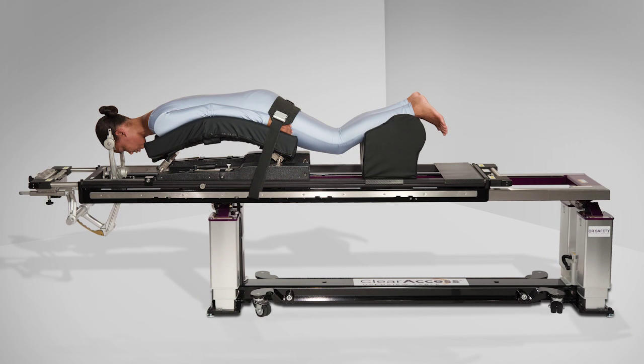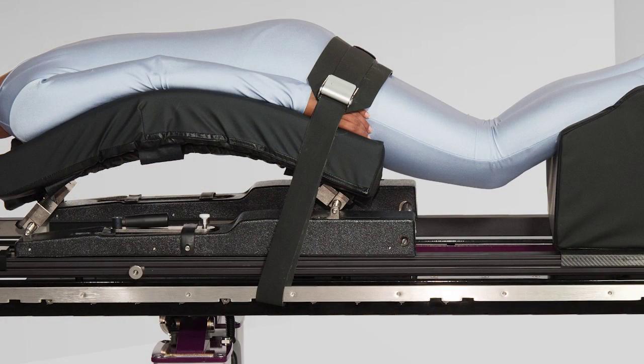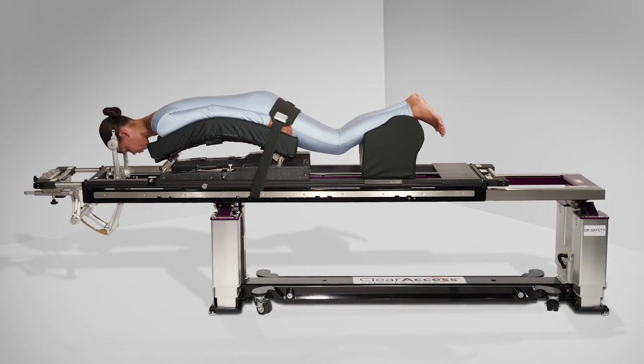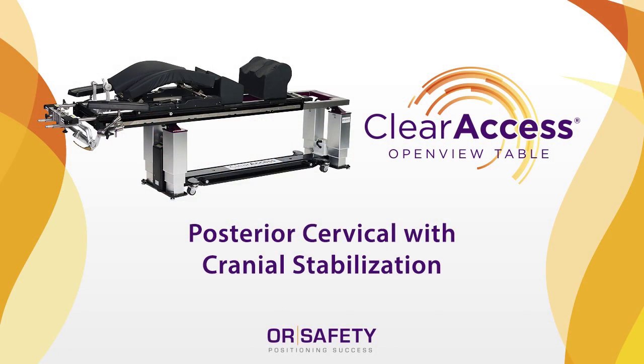Of course, when extreme angulation of any operating platform is employed, it is critical to adequately secure the patient to the table. Please consult the Clear Access instructions for use with any further questions.